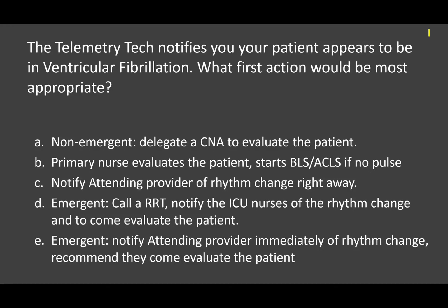The telemetry tech notifies you that your patient appears to be in ventricular fibrillation. What first action would be most appropriate? Well, if your patient's in VFib, we know that that's one of the lethal arrhythmias. So is this non-emergent? Absolutely not.